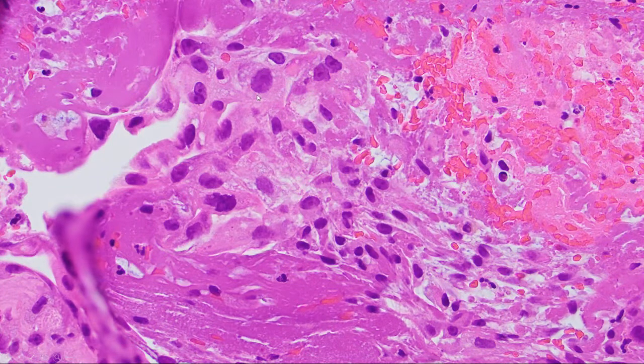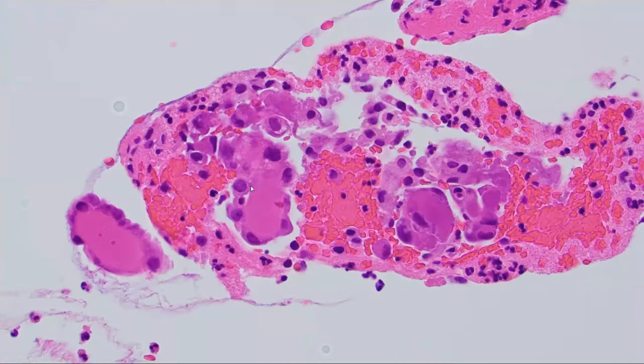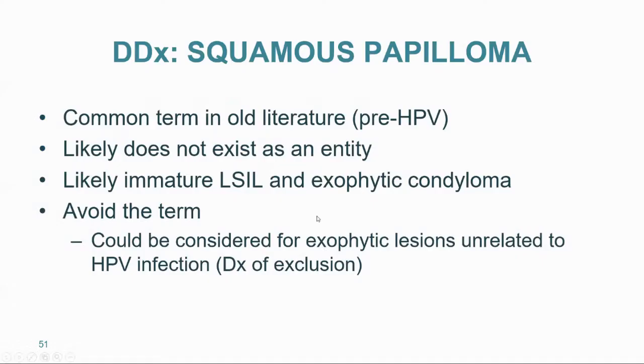These nuclei are atypical, but you can also appreciate the abundant foamy or bubbly granular cytoplasm, which is a hint. And you see similar atypical changes in stromal cells or in endothelium, like in this case. All that, if you have the history, will be supportive of the diagnosis of radiation-induced atypia, which is a benign diagnosis.